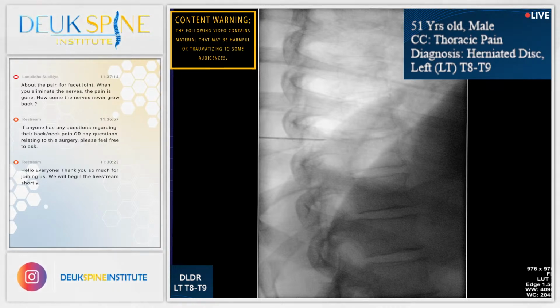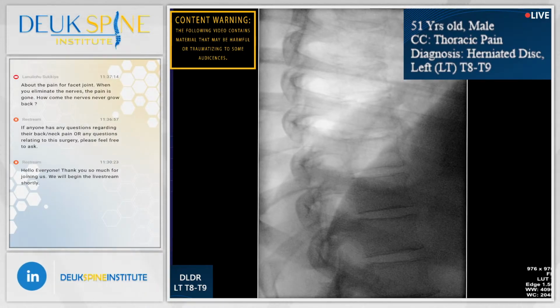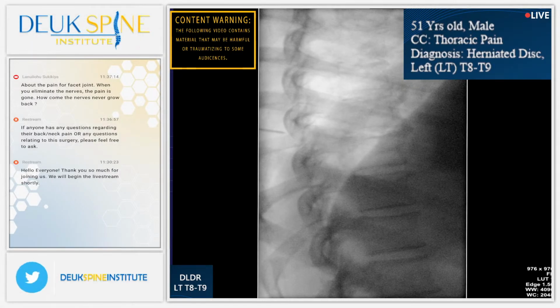I'm going to start a little bit higher. Try again. Shot? Shot? Shot? AP?